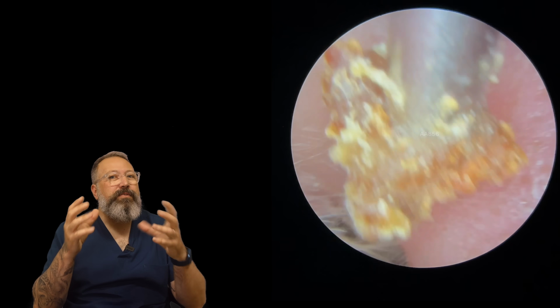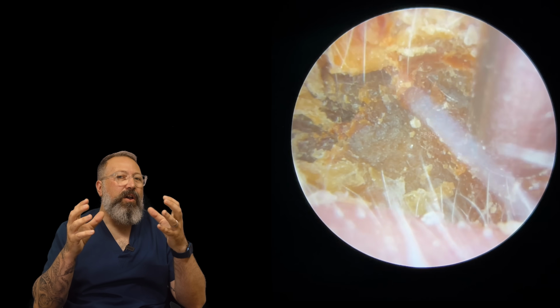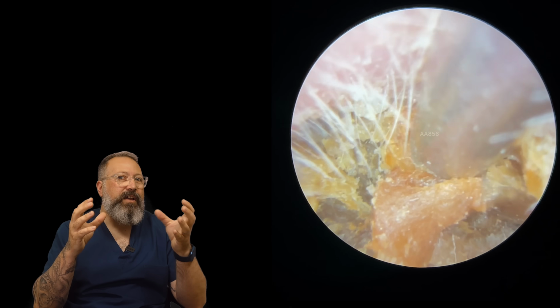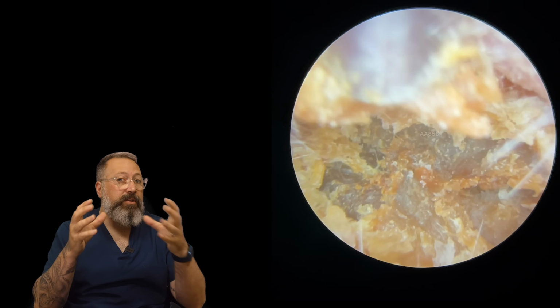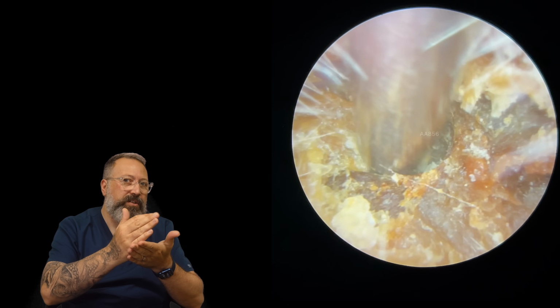So what I'm doing here, which I've used a few times in the past, is I'm using the side of the suction tube almost a bit like a curettage tool. So you've got a bit of a combo of both. You've got a combination of the suction being used and the side of the tube being used almost like curettage. So you're kind of passing along the surface. What I'm doing is almost scraping along the surface of the wax, which you can see me doing here.